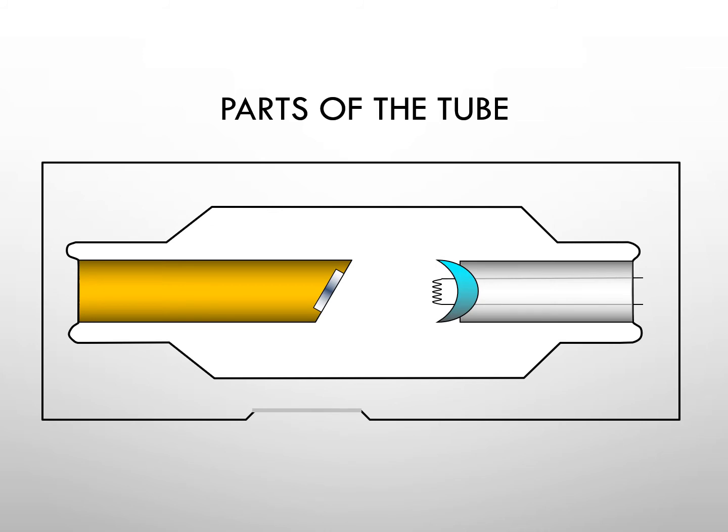It is important to know what the various parts of the X-ray tube are made from and why the material is used. The cathode is a thin tungsten wire. Tungsten is expensive and difficult to work, so it is used for small parts that will be subjected to high heat. Tungsten has a very high melting point.